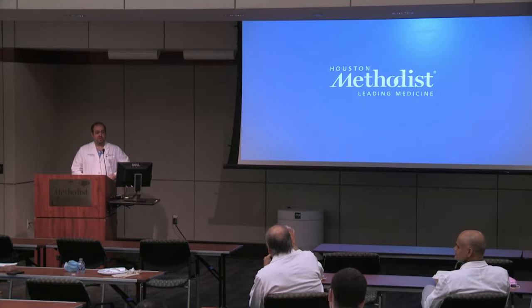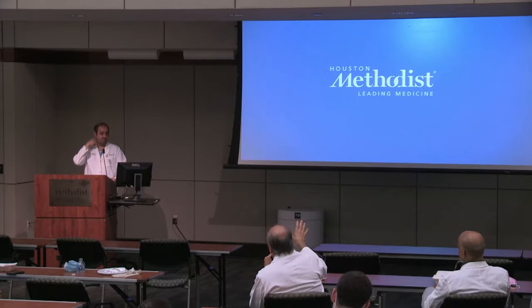You mentioned the calcification artifact that you get from CT, and is that just partial volume, or is there more than partial volume involved causing the blooming? Because partial volume should only be 1 pixel.